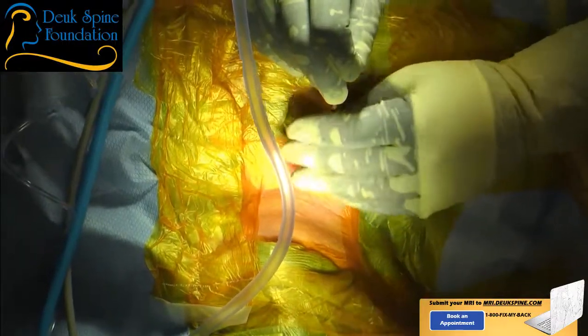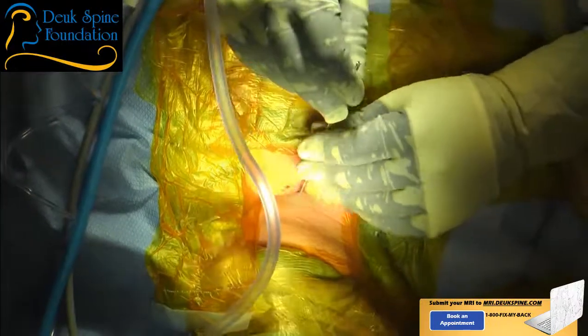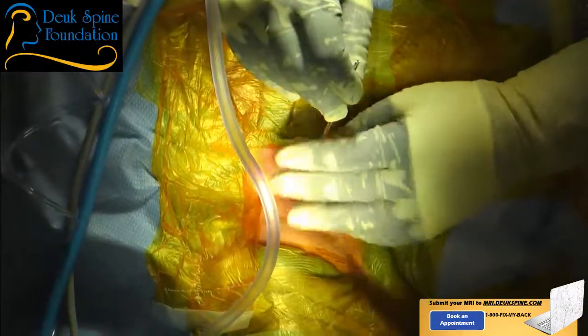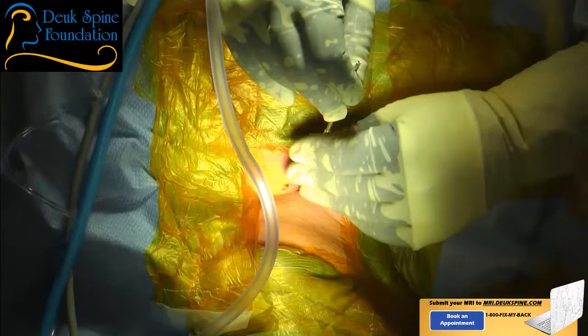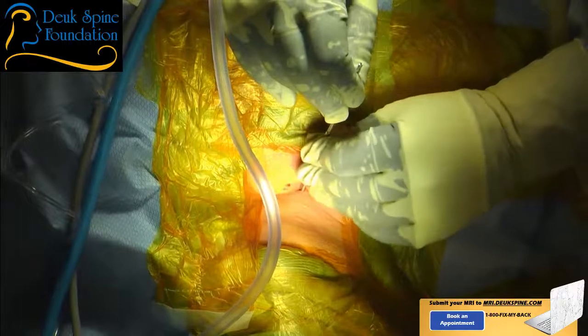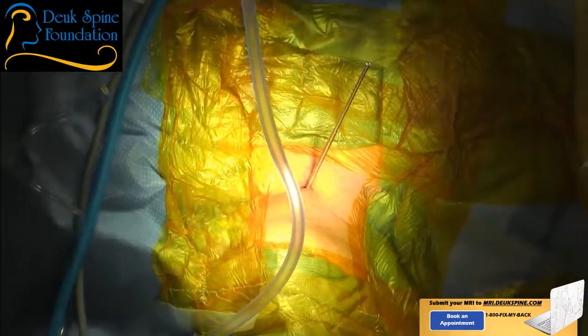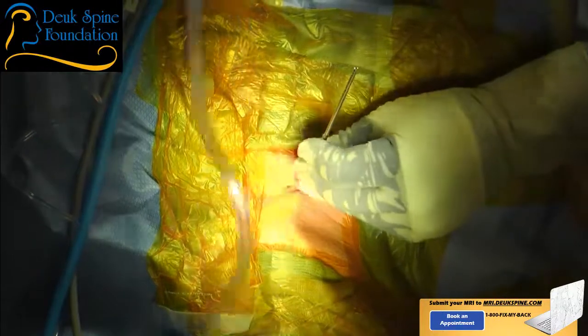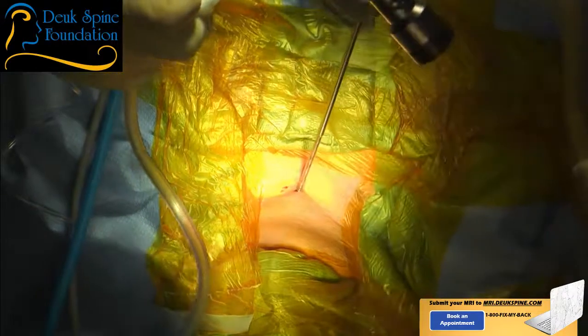More soft tissue means, hey, watch the scope. More soft tissue means, yeah, just nice and gentle. You're doing great, Jordan. And I'm bringing the tubular retractor down. I can feel the front of the spine. So we're right there. And now I need to advance the tube that we're going to do the endoscopic surgery through. We're going to advance that down.